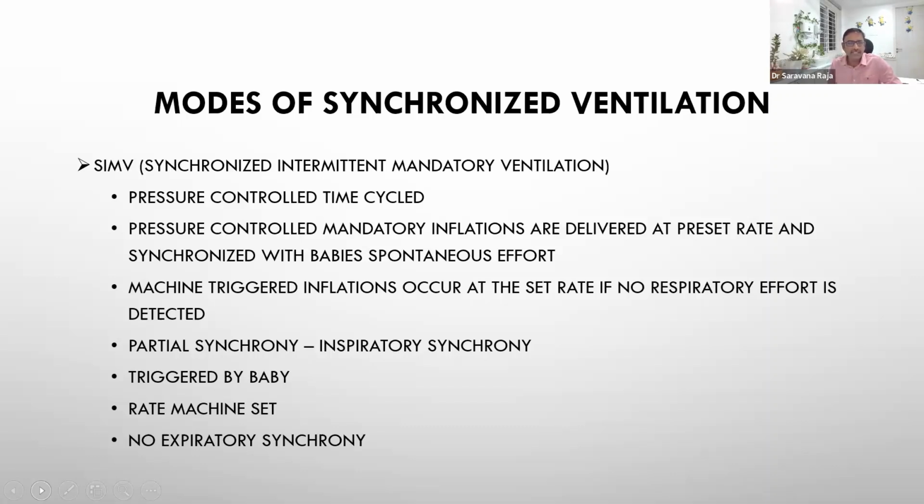You can see it is partial synchrony, only inspiratory synchrony occurs. So triggering is by the baby and the machine will set the rate in the machine. Since it is a time cycled one, no expiratory synchrony occurs.